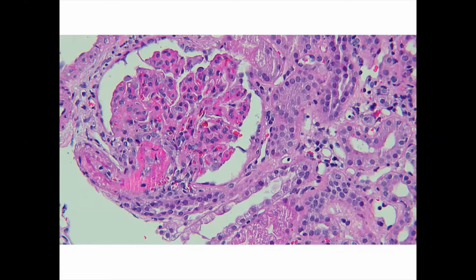Okay, those are saying hypercellularity. Where is the hypercellularity? This is H&E, of course. Okay. Nice. Okay, all right.